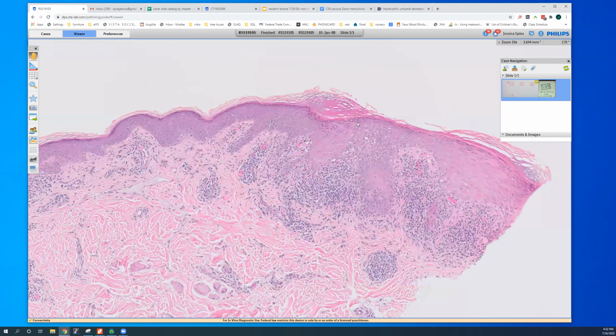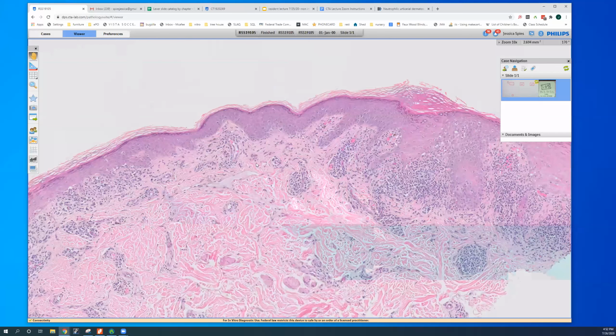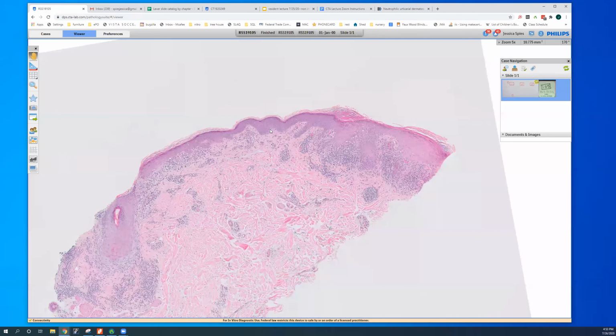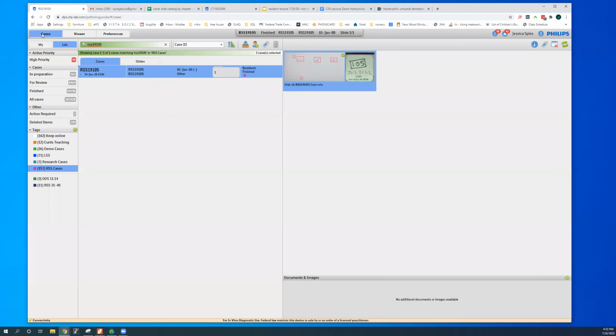If it was a single lesion, you would think about lichen planus-like keratosis, of course. And in that event, you would be looking for changes of solar lentigo or seborrheic keratosis on the side of it. This is LP. And for lichen planus-like drug, things that can be helpful are that there's often parakeratosis, and often there are increased numbers of eosinophils. So, next case.